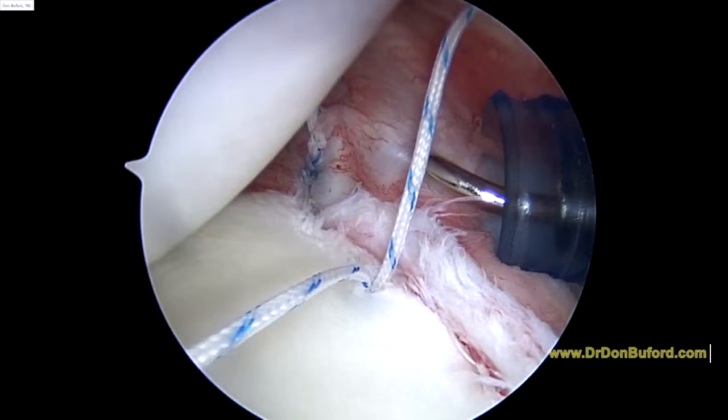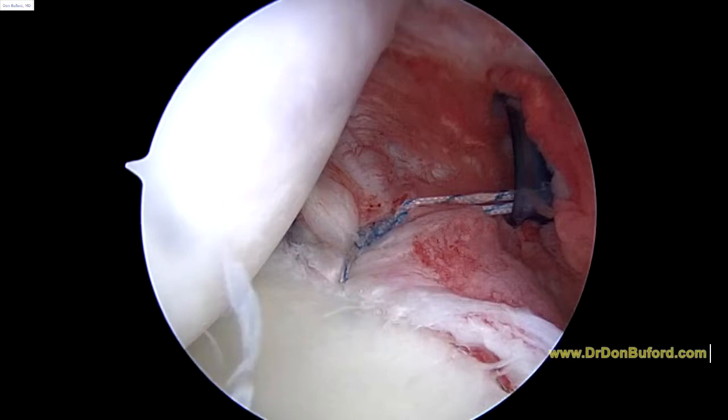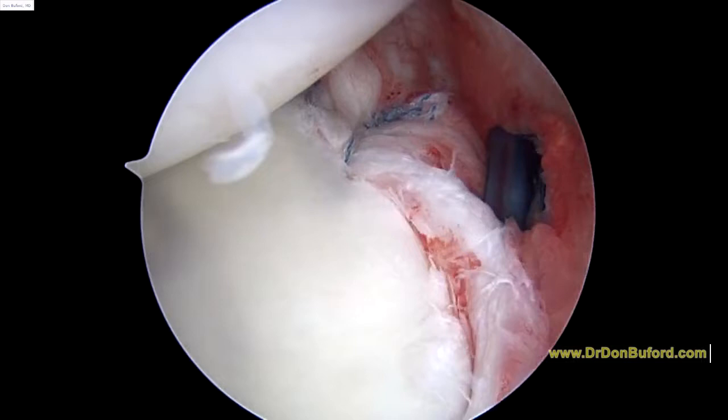We've laid about the capsule underneath the labrum. So we're just cutting the tails from the second stitch — you can see it's looking a lot better. I'm happy with the way that's taking shape. We're now going to likely have to place one more stitch right at the tip of that blue pin. You can see how this is still loose. We're going to repair that next.